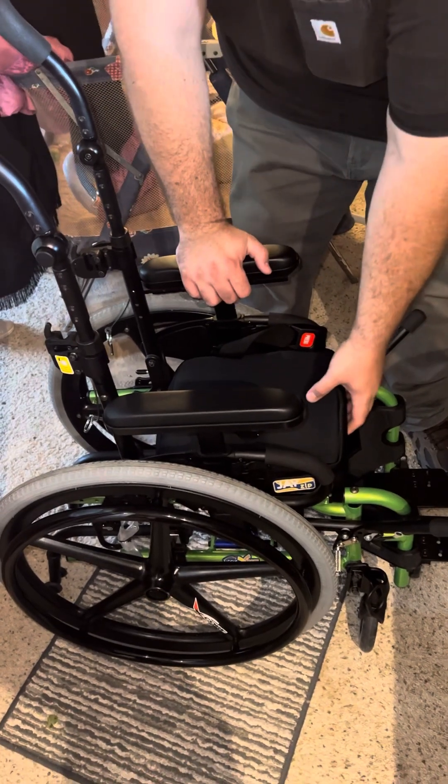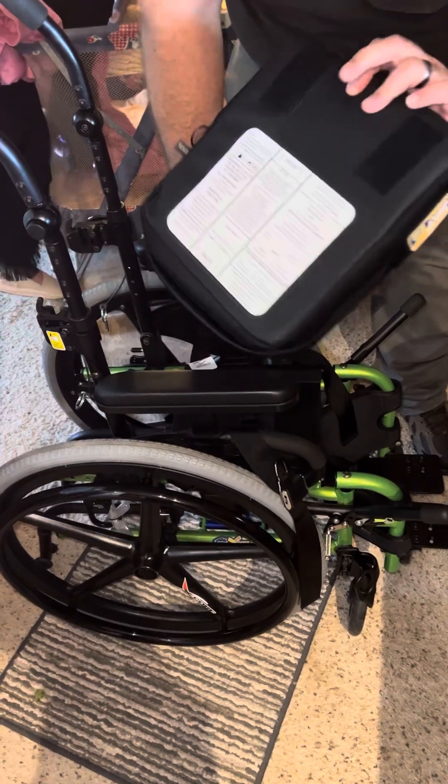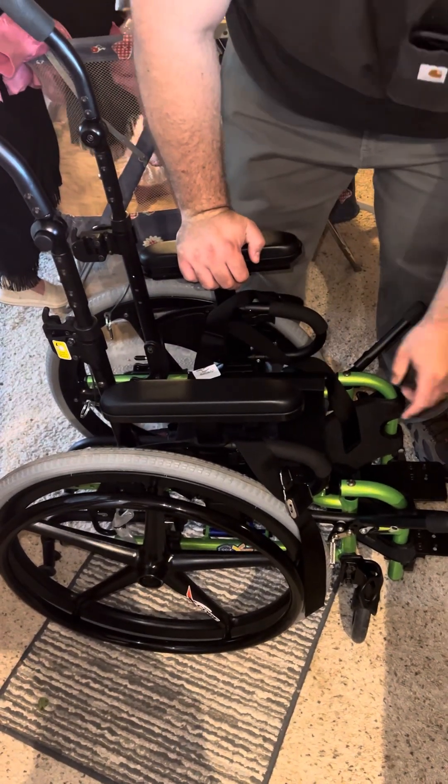Then you take the seat, loop those over, and take the seat off. It's just Velcro.